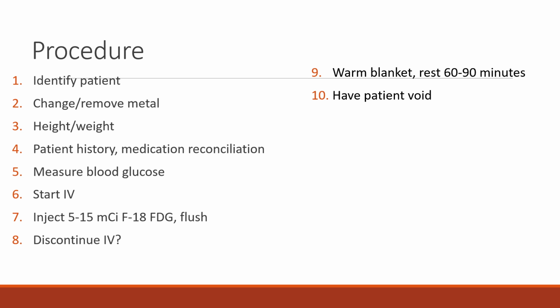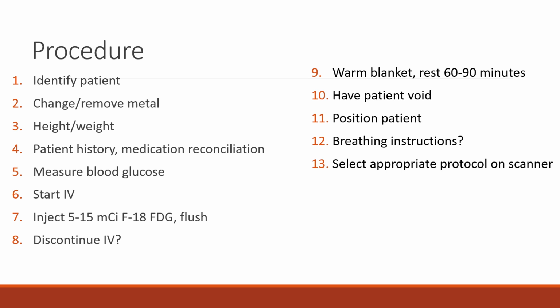Now, it's important to keep the patient warm. That will reduce the adipose tissue, the brown fat uptake, and things like that. So cover them in a warm blanket, keep them warm, have them rest for about 60 to 90 minutes, and then you'll have the patient go to the bathroom right before you put them on the camera.